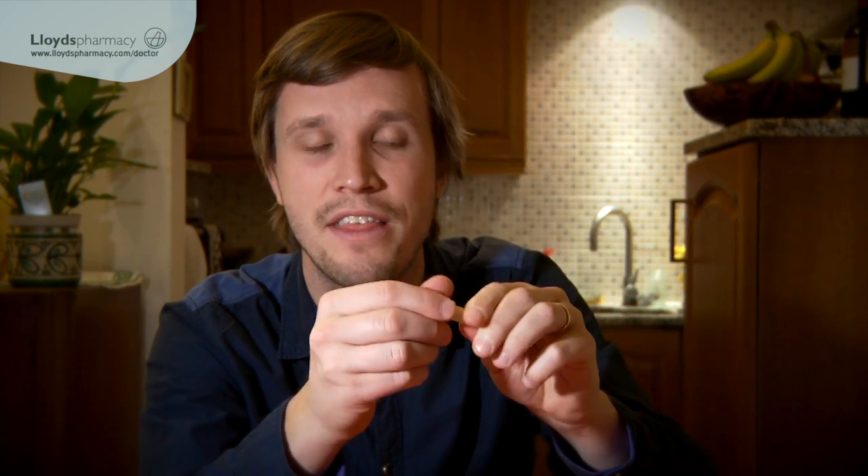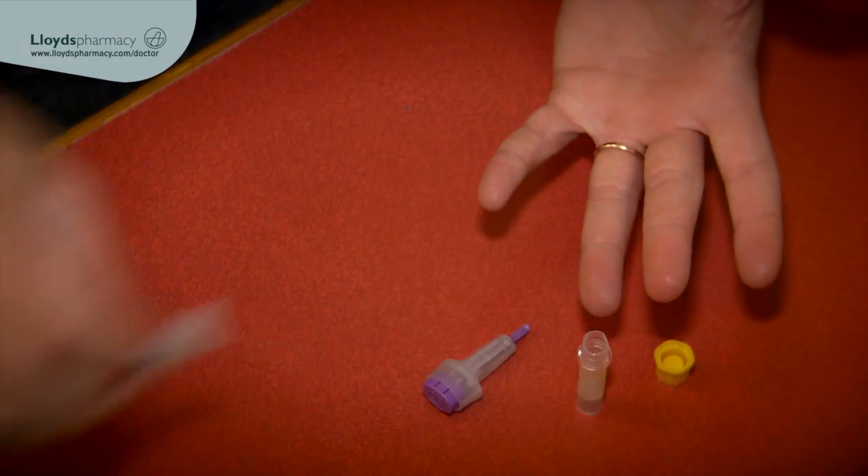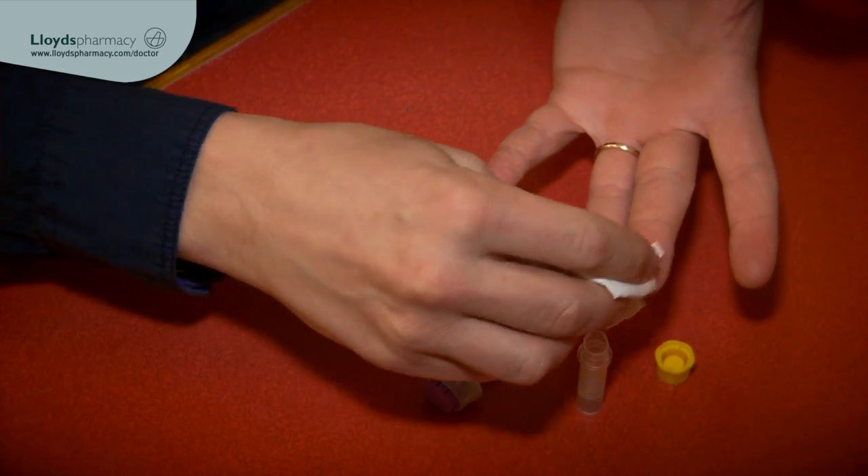I'm a bit nervous about this but first things first I'm going to go and wash my hands. Now to get the blood collection bottle ready I've got to fill it to the top line. I'm going to take the lid off and have it next to me ready for when I pierce my finger. I also need the alcoholic strip so that I can sterilise the end of my finger. So first things first I'm just going to sterilise the end of my finger and wipe away any moisture with a clean tissue.